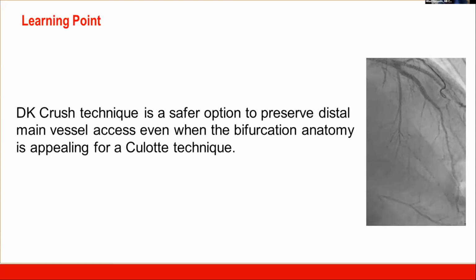Yeah, of course, they were ready on the table, and we thought about the difficulty of wiring the side branch, and we expected that difficulty. Just to highlight that probably even with an angled microcatheter, your access within this chamber of the aneurysm is not really guaranteed because of the coiling geometry of the bifurcation.